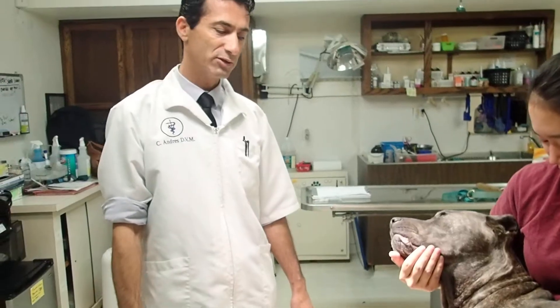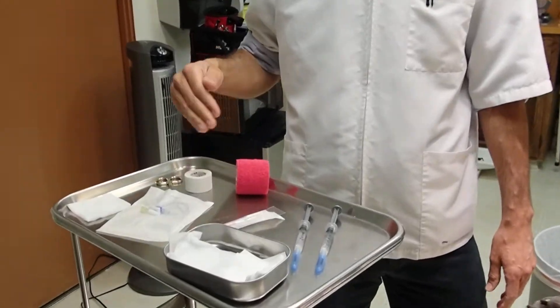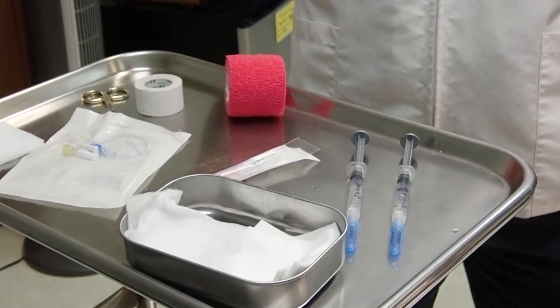She's going to have a short procedure today, so we'll be putting in an intravenous catheter. We thought we'd go over how I place an intravenous catheter. Before we actually put it in, I just wanted to go over some of the equipment, instruments, and supplies that we need, because that's always key — having all your supplies ready before you go.